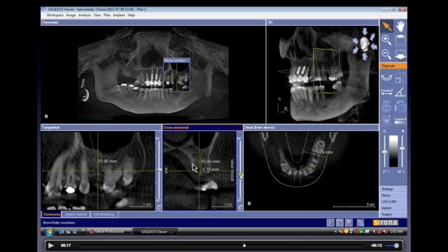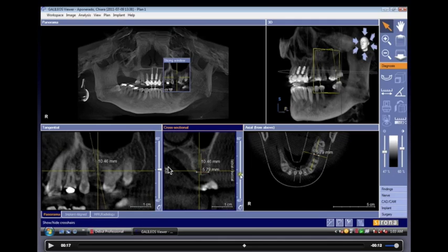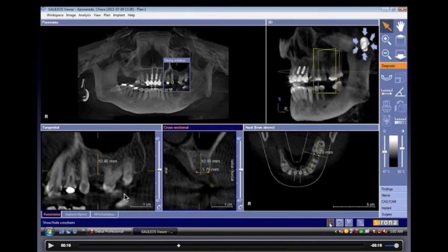That's one of the pitfalls — we need to retrain ourselves when we look at three-dimensional pictures. When we look at this cross-section, we are actually looking at the slice. And because our computers are now that good, we could tell the computer to look at different views depending on which area we'd like to see. Since I want to place the implant along this particular line, I should be looking at this slice more.